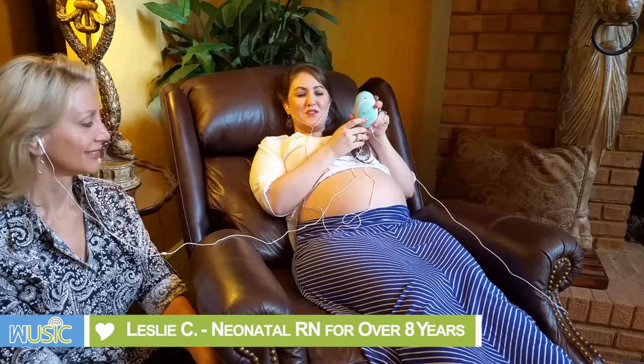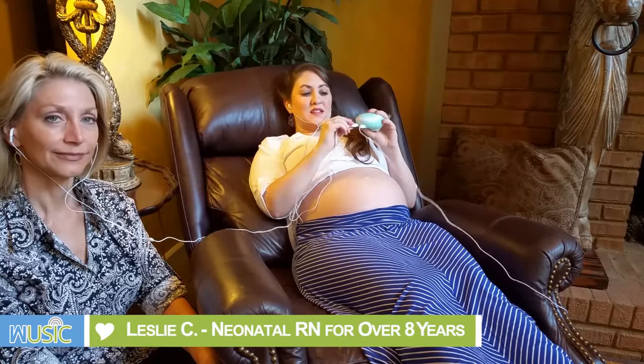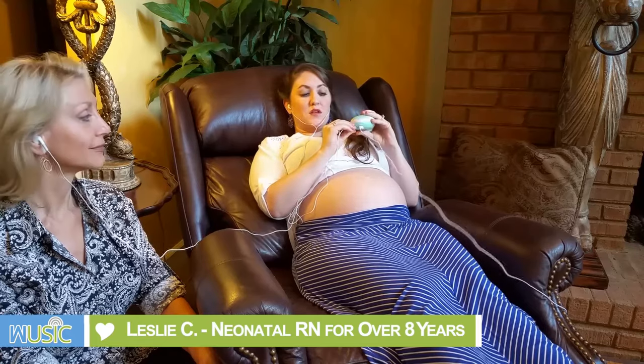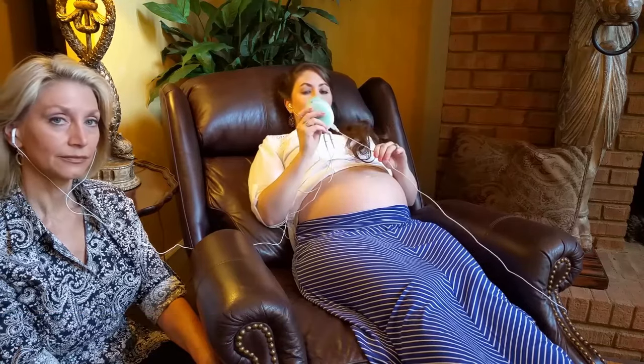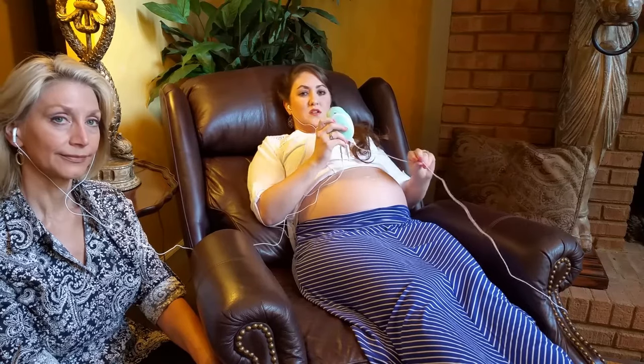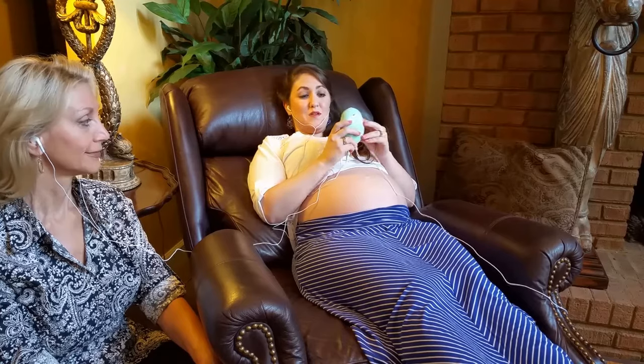Here's the Womb Music Baby Bump Monitor. We already have it configured for two people to listen to. It has a split system on the bottom that you connect, with two earbuds connected. We also have the computer cable connected to an external speaker so you will be able to hear the heartbeat as well.